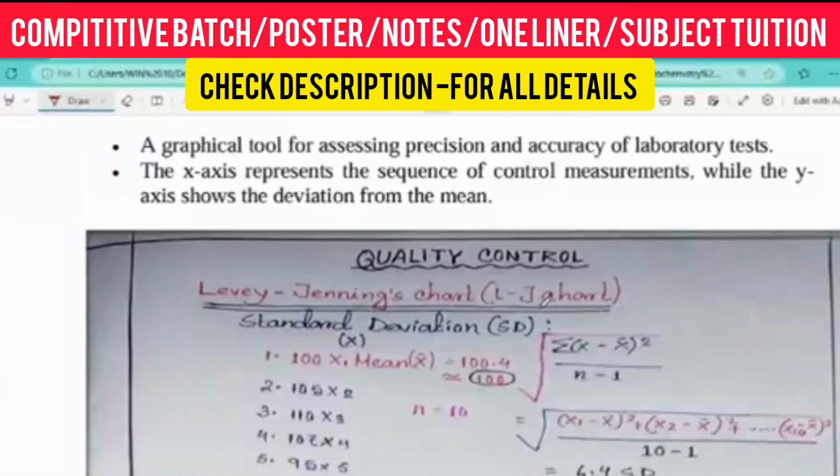Whenever you face any viva related to clinical biochemistry, the first question will be, do you have any idea about the Levey-Jennings chart? If you are not able to say that, they will not give you the job, because it is a very basic idea of clinical biochemistry. When you go to the laboratory and say we have done lots of batches and lots of study related to clinical biochemistry, but you cannot talk about the Levey-Jennings chart, they will think you are saying the wrong things or you are not capable of doing the job in their laboratory, because you have not remembered the Levey-Jennings chart. It is a very fundamental thing.